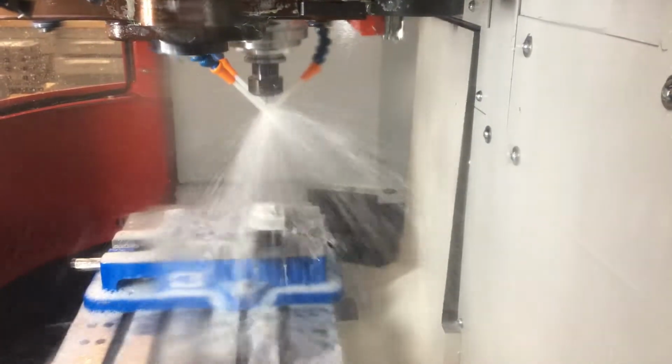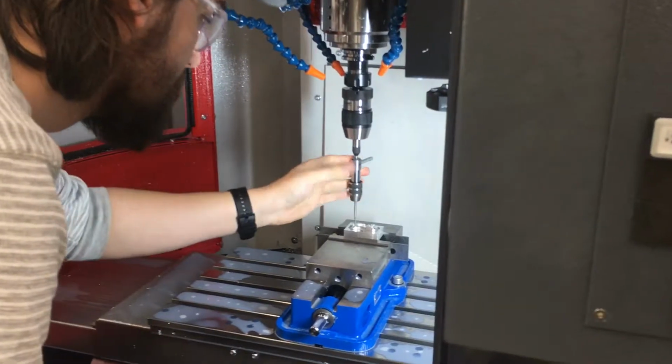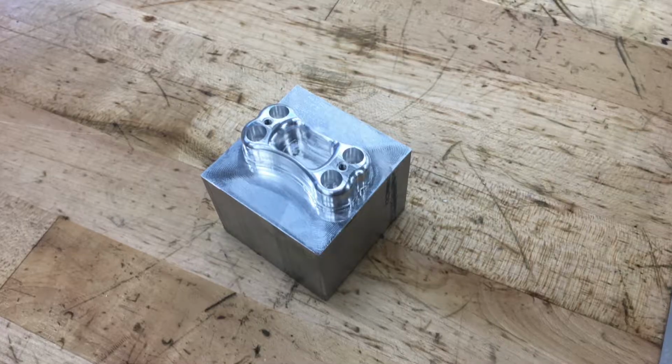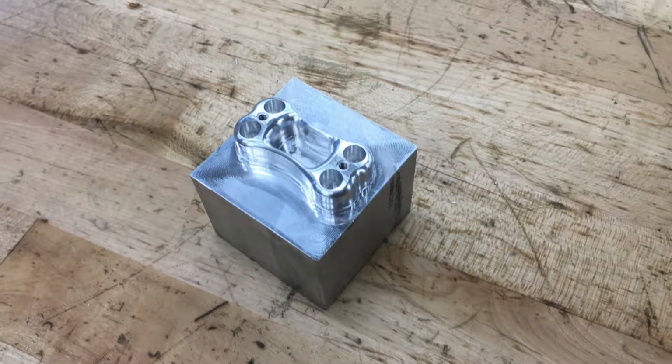Finishing off in the CNC, the screw holes are then tapped to create threads, and air is applied to remove metal residue. Here's the part right after being removed from the CNC.